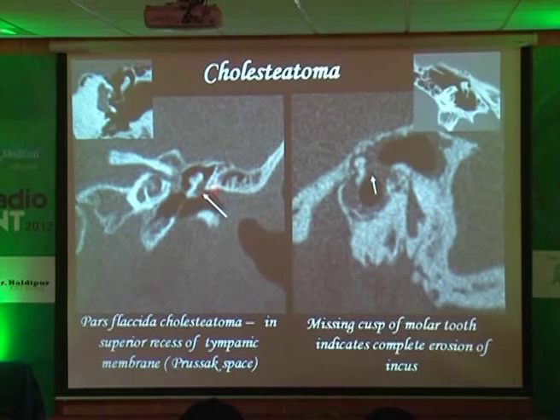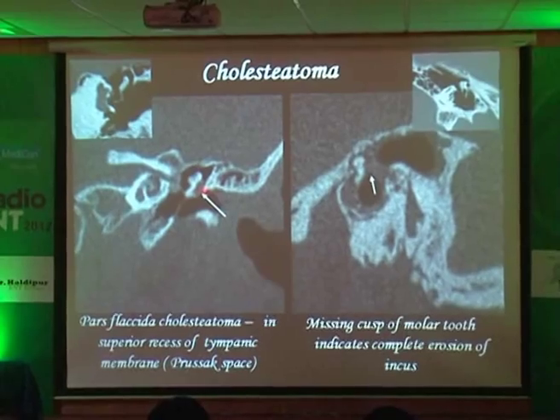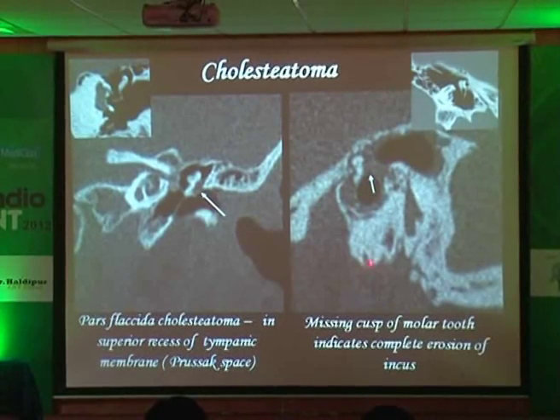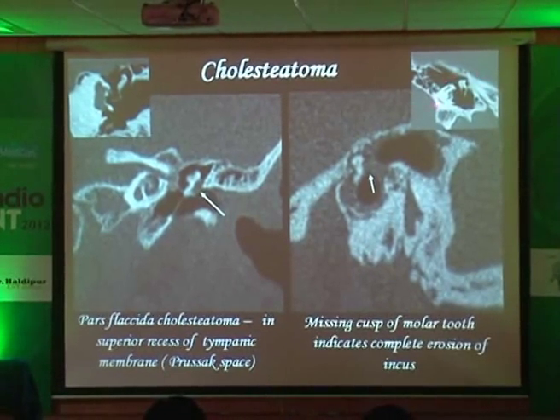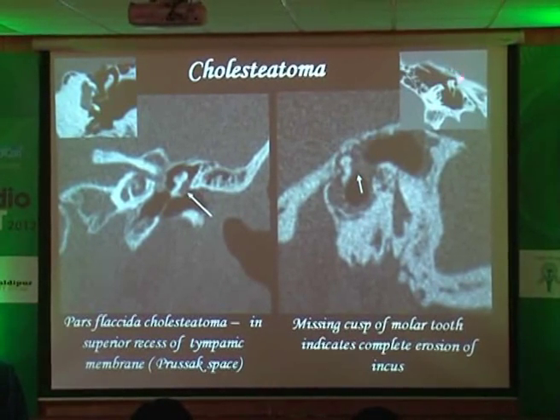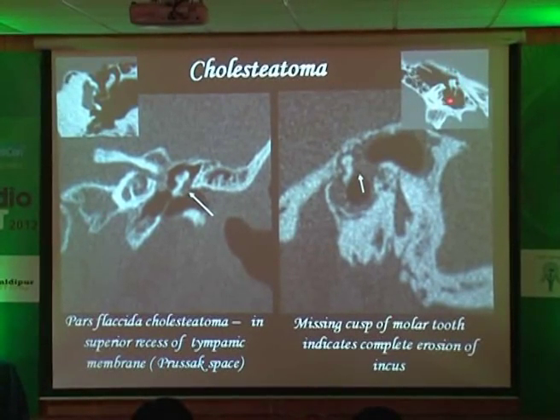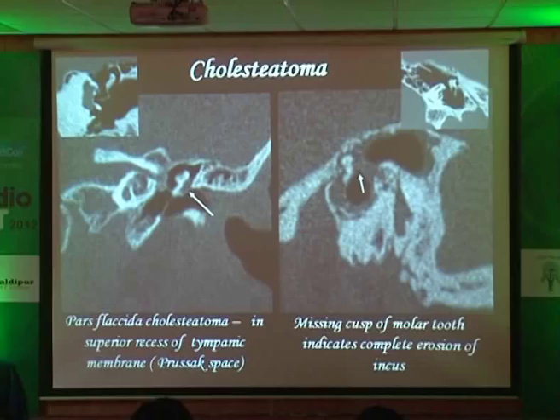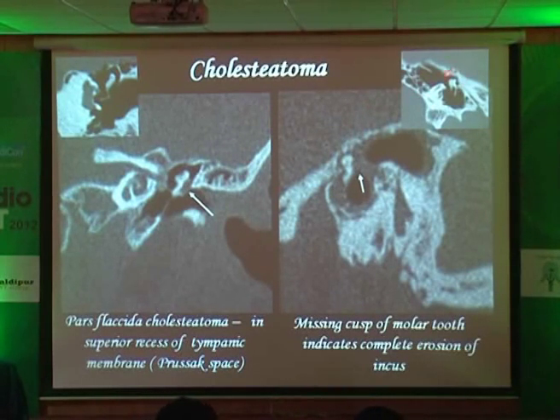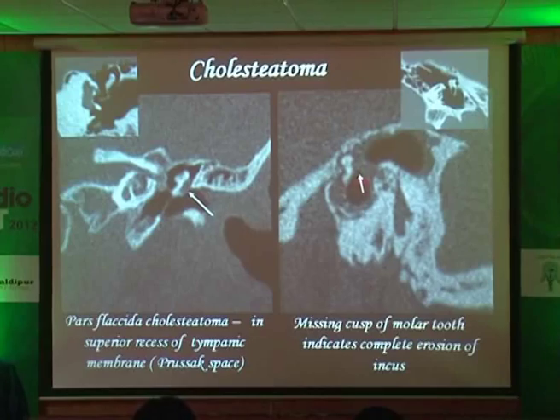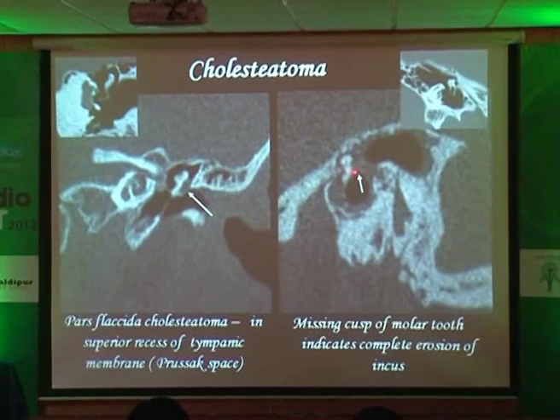This patient also had erosion of the scutum. The scutum is beautifully seen in normal cases, but here there is erosion. Dr. Manoj also mentioned the molar tooth appearance — anteriorly is the malleus, posteriorly is the incus, giving a molar tooth appearance. This cholesteatoma has eroded the incus, causing loss of the molar tooth sign. You see the malleus intact, but the incus is completely eroded.